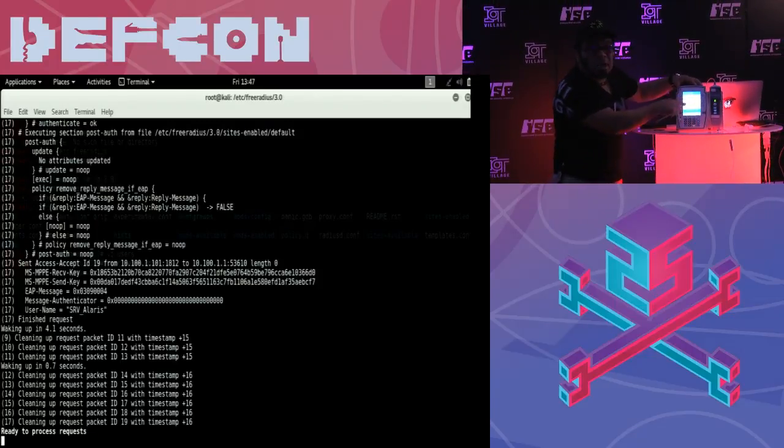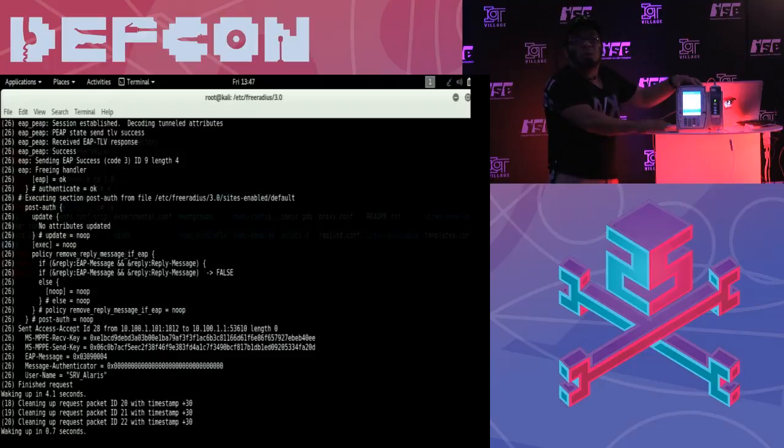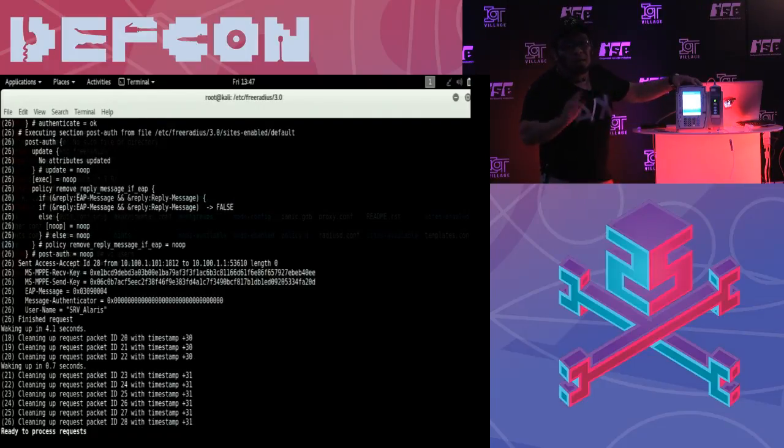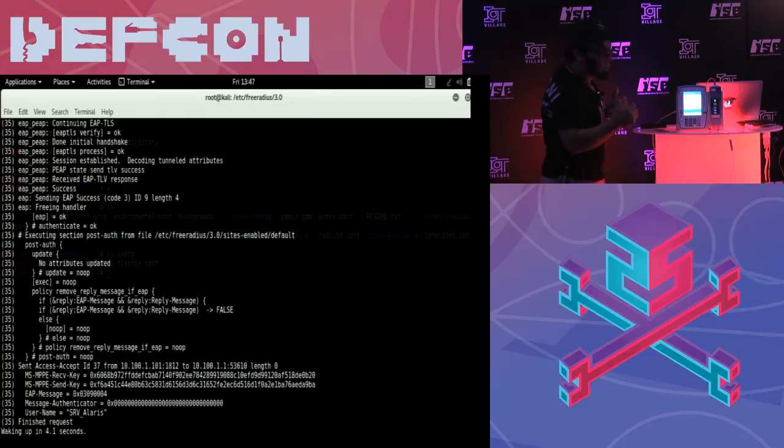But as you can see, we are giving it the IP address. So as soon as we have the established connection with the server, we are able to just replace whatever we want and then take it to us, do a man in the middle. But at the end of the day, the most important thing here is that we can fully replace the configuration stored in the internal RAM.